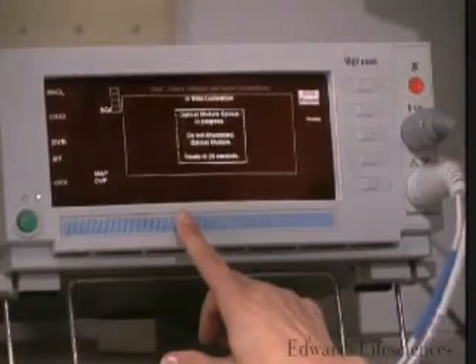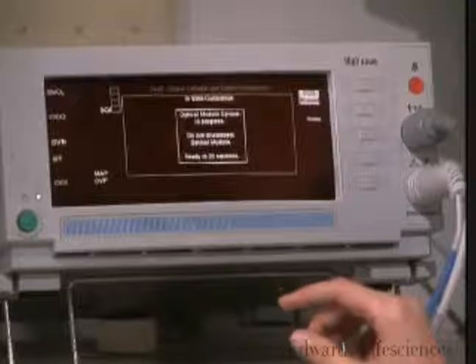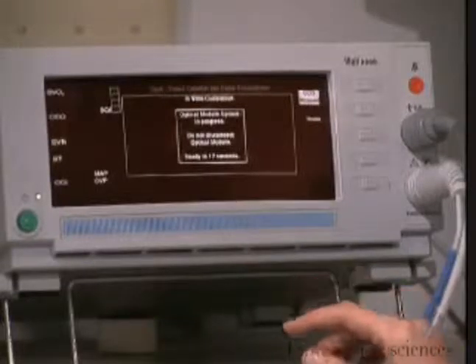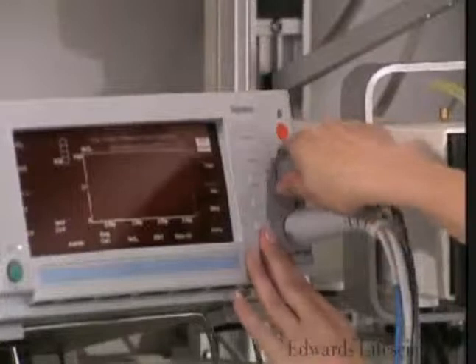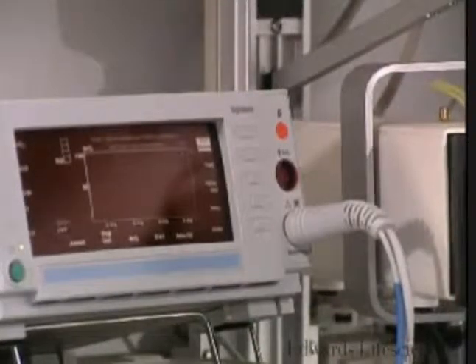This catheter requires calibration prior to use. Follow the manufacturer's instructions for both in vitro and in vivo calibration. The calibration completed at the time of setup will remain valid and retrievable unless the optical module is disconnected from the catheter. Always disconnect the optical module cable from the monitor and not the catheter for patient transport.